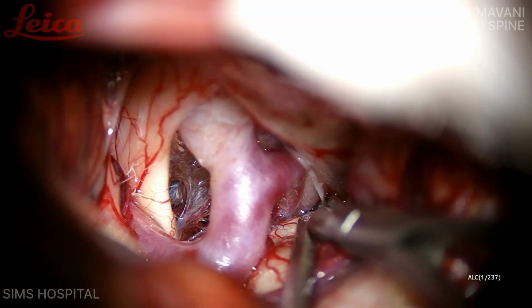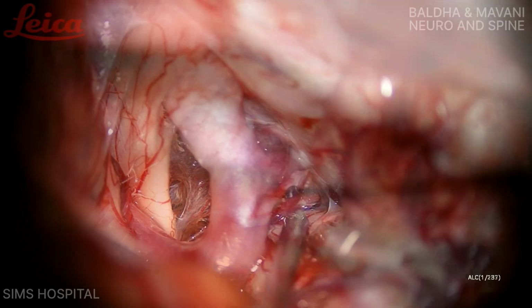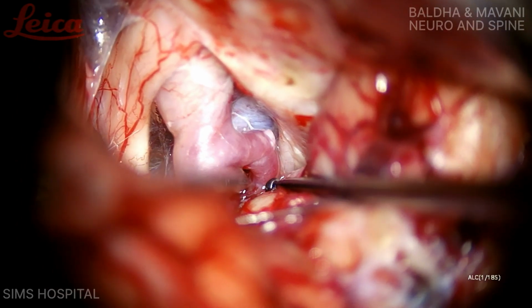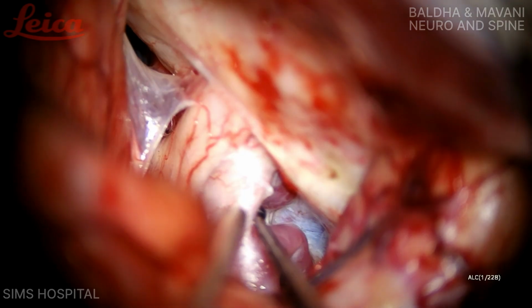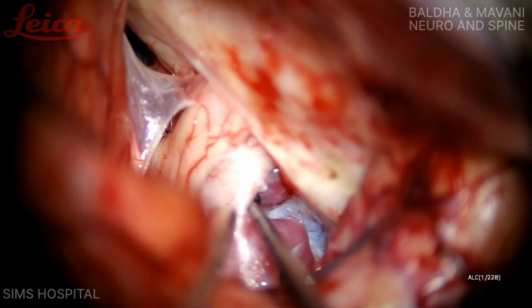The internal carotid is now exposed. You can see the dominant large PCOM here. Still, the aneurysm is not in view. The aneurysm is hidden here behind the anterior clinoid process, requiring ACP removal.